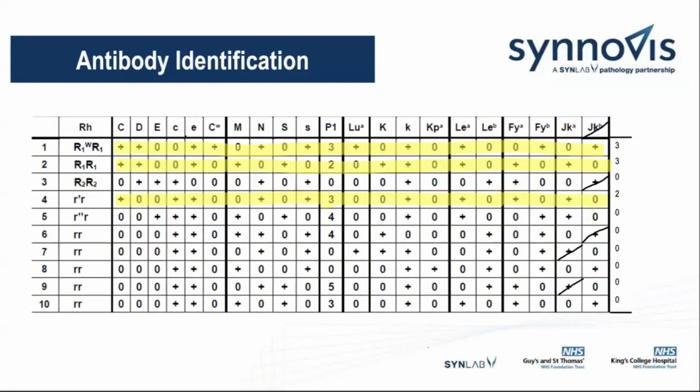So if you've noticed, I'm using homozygous cells, and I'm using an example of 2 to make sure that I can exclude. So I do this all the way along, and then I get to my final. So I do this for all the antigen families, and I get to my final section here. As I mentioned earlier, I can't exclude on that M cell or the N, because that is a heterozygous reaction. So I'm going to select another cell to be able to exclude on. So I've done that there.